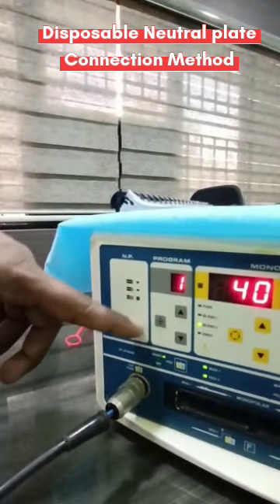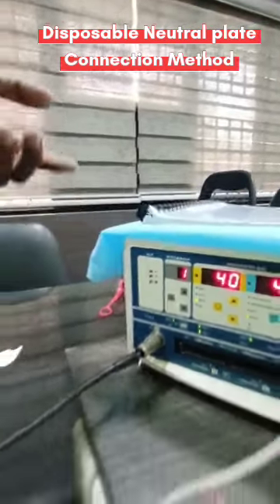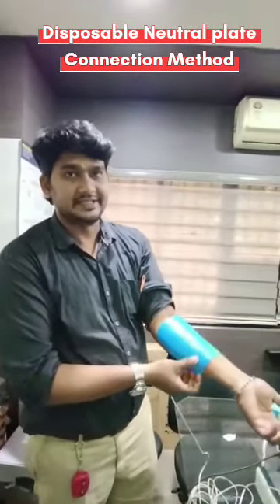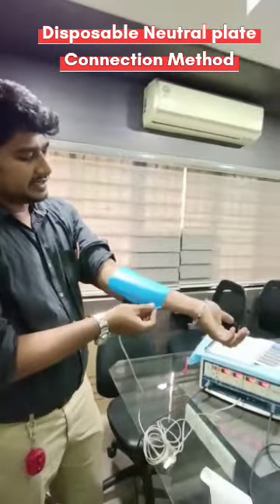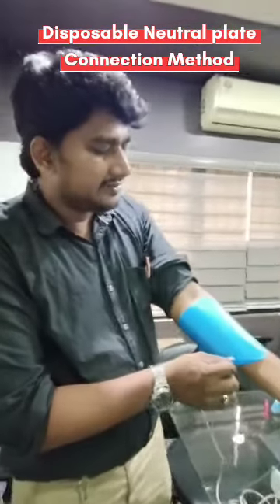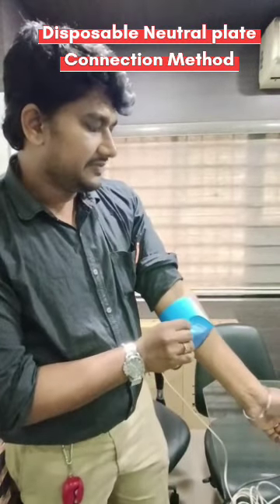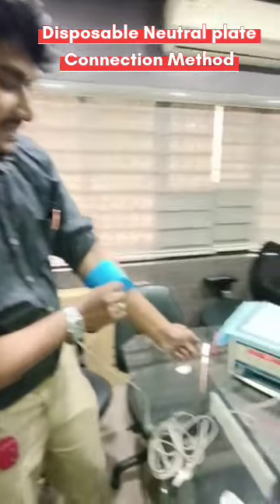I'm going to demonstrate how it works. During surgery or during some position change of the patient on the operating table, the patient plate can get partially removed. See that — for example, if I remove it slowly like this, you can see this indication change.